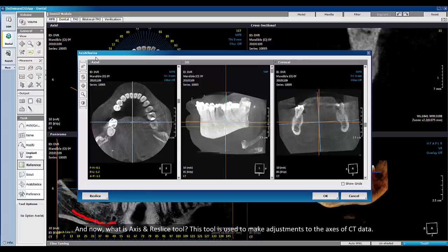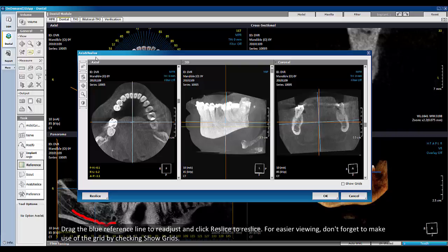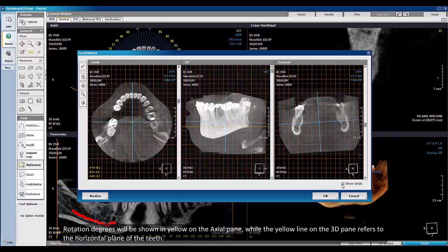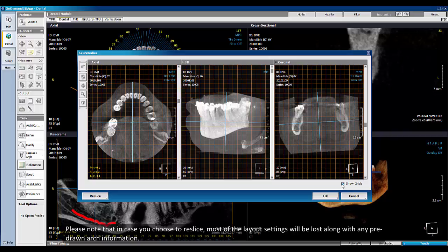What is the Axis and Reslice tool? This tool is used to make adjustments to the axis of CT data. Drag the blue reference lines to readjust and click Reslice to reslice. For easy viewing, don't forget to make use of the grid by checking Show Grids. Rotation degrees will be shown in yellow on the axial pane, while the yellow line on the 3D pane refers to the horizontal plane of the teeth. Please note that if you choose to reslice, most of the layout settings will be lost, along with any pre-drawn arc information.